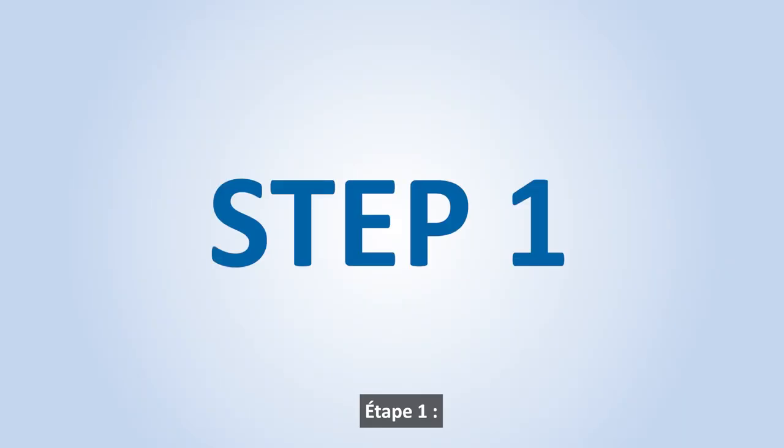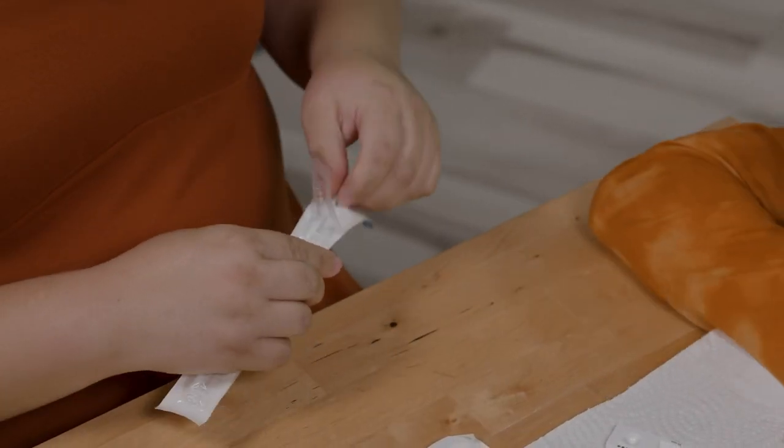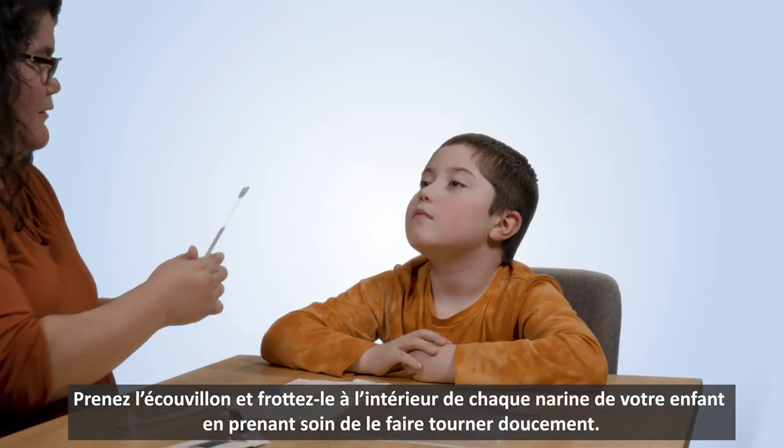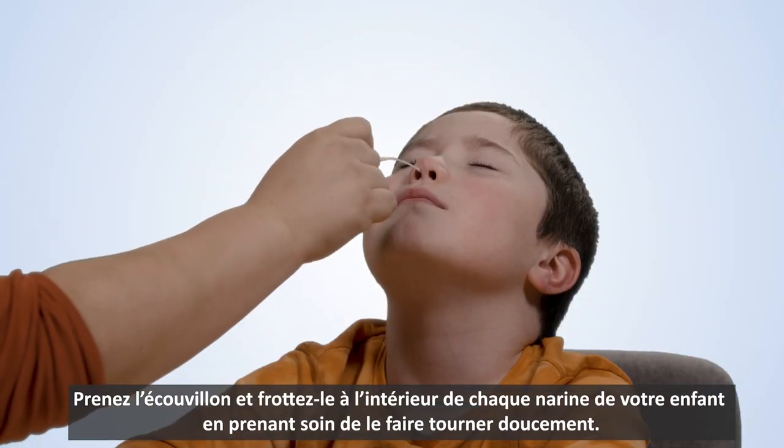Step 1. Open the swab package and remove it. Take your swab and gently rub and roll the swab five times on the inside of each of your child's nostrils.